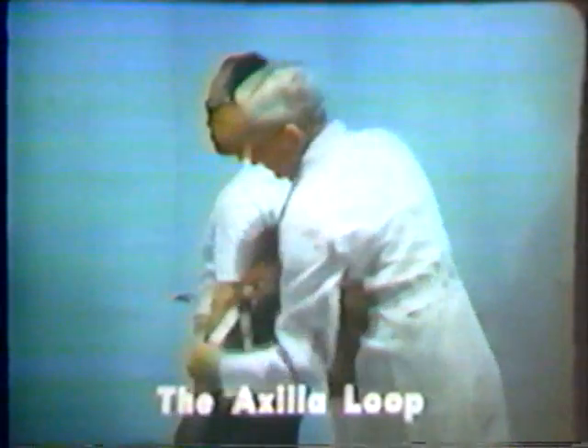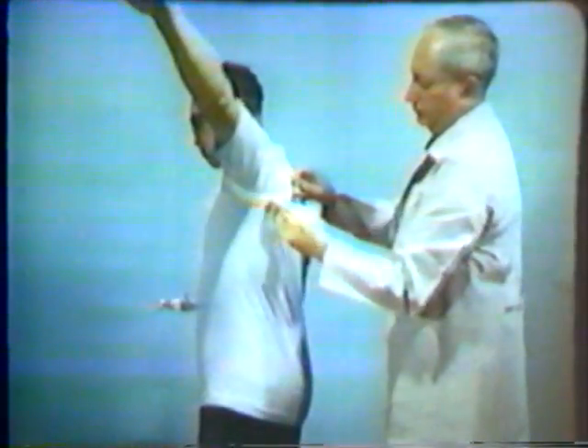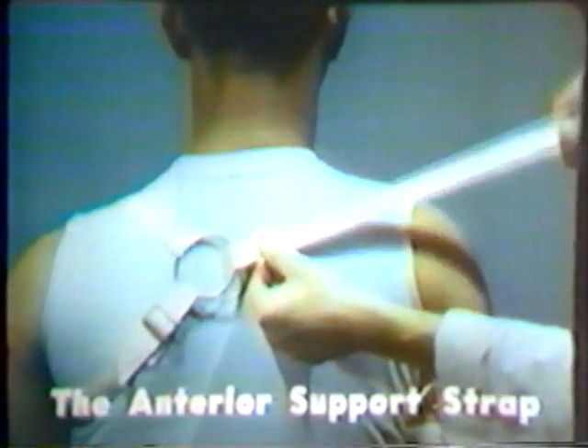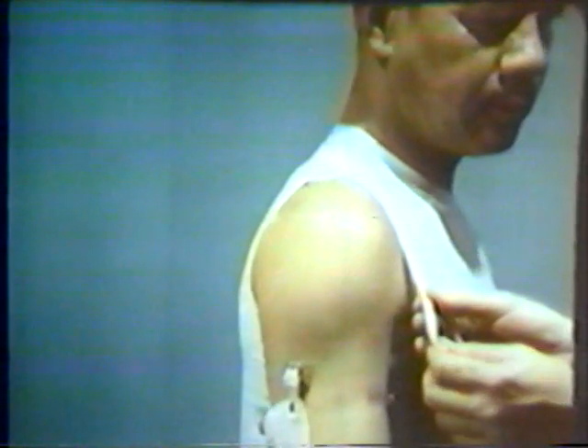The first component of the harness consists of a Dacron loop, which passes under the axilla on the sound side and provides a secure anchor for the entire harness system. The second element of the harness is referred to as the anterior support strap. The anterior support strap originates at the ring, passes over the shoulder on the amputated side, and is fastened to the prosthesis by two straps at the anterior proximal margins of the triceps pad in the form of an inverted Y.